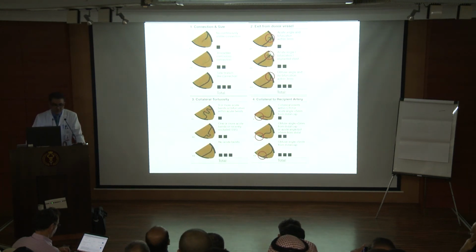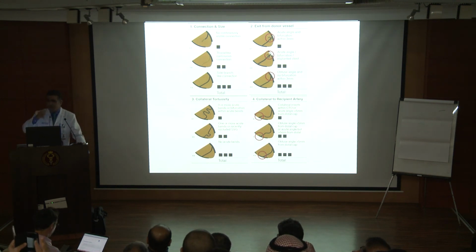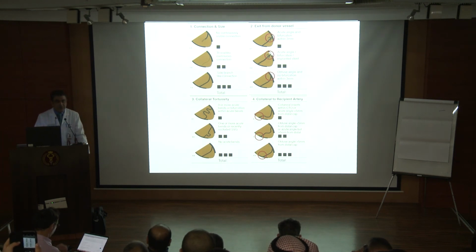There's also a scoring system for collaterals. Margaret, one of our colleagues as well, has done extensive work and it's been published. It's really good because it gives you an insight into how much detailed attention people pay to these collaterals and how much you really have to sit down and analyze them. It's very common when you do a case and the patient has fantastic septal collaterals, you look at it and when you try, you will be stuck. You keep on trying and you can't cross.